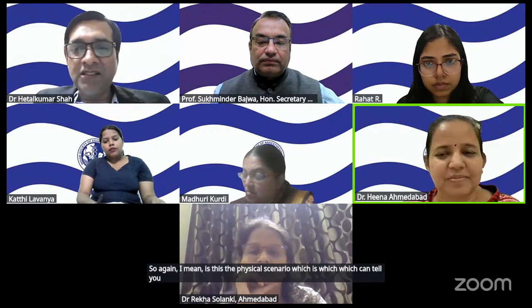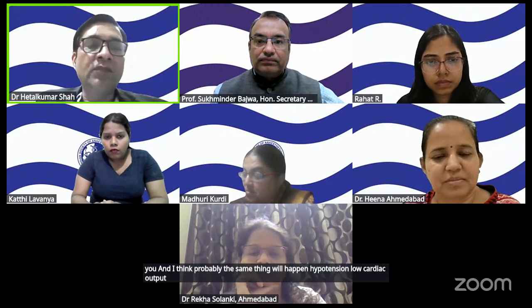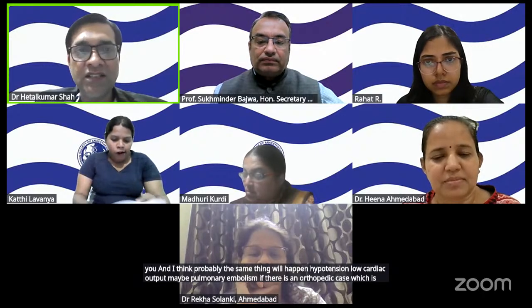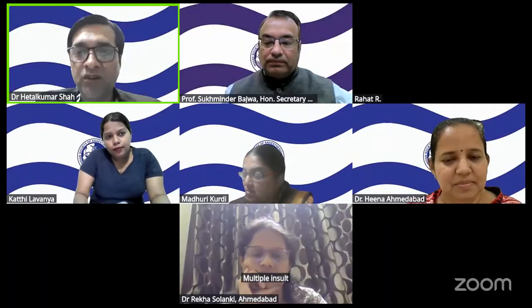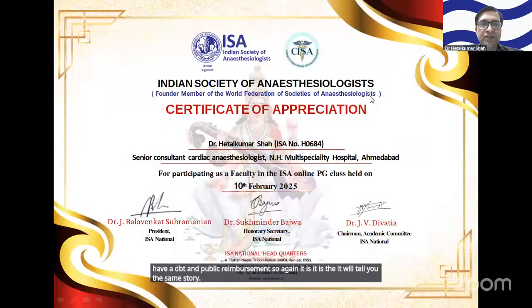And probably the same thing will happen with hypotension, low cardiac output, maybe pulmonary embolism, if there is an orthopedic polytrauma case with multiple insults and possibly prolonged immobilization, they could have a DVT and pulmonary embolism. So again, it will tell you the same story.